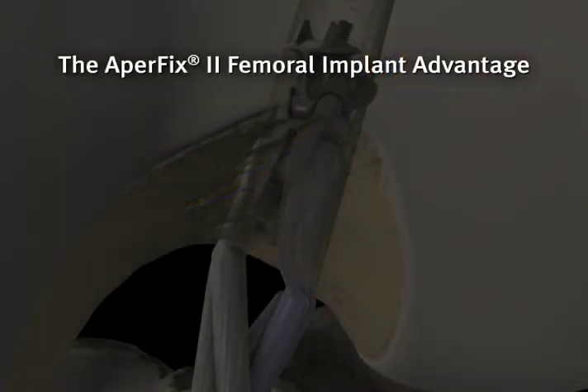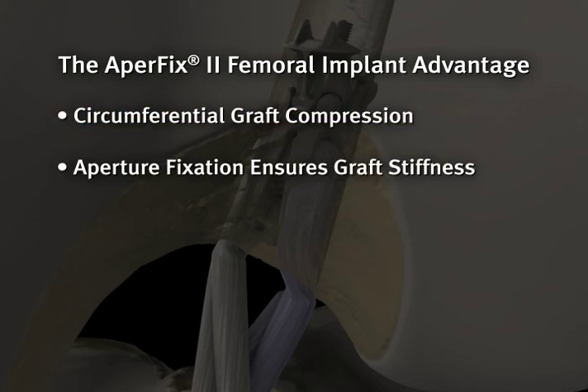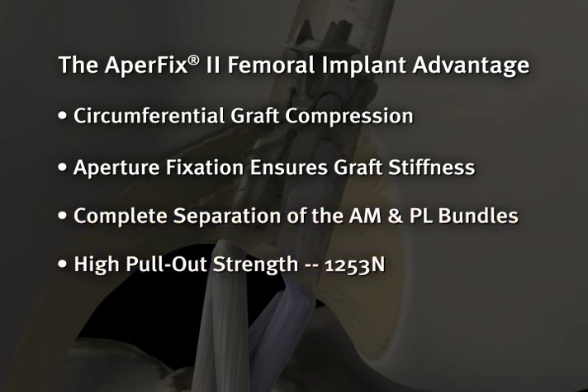The APA-FIX femoral implant has a number of beneficial differentiating features. The system allows for circumferential graft compression, aperture fixation, complete separation of the AM and PL bundles to match that of the native ACL, high pull-out strength of 1,253 Newtons, and unparalleled ease of use.